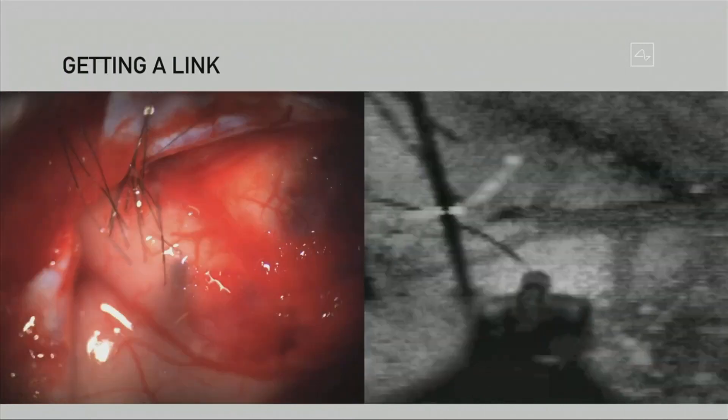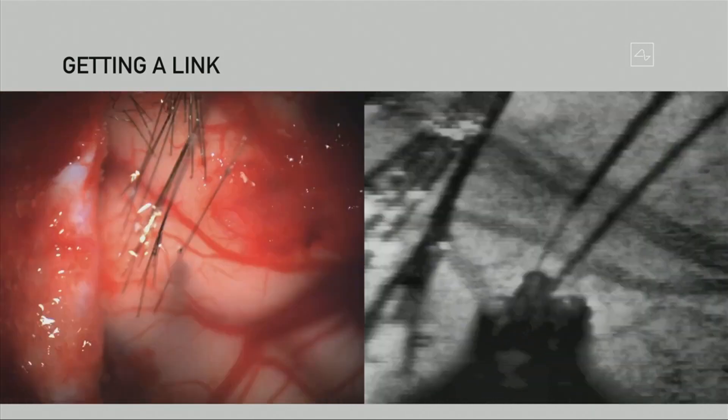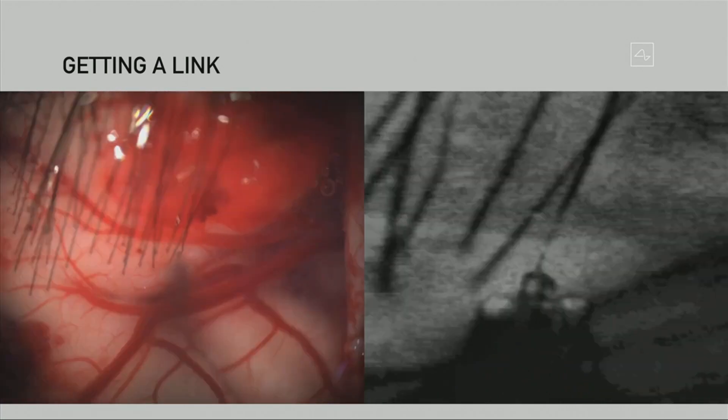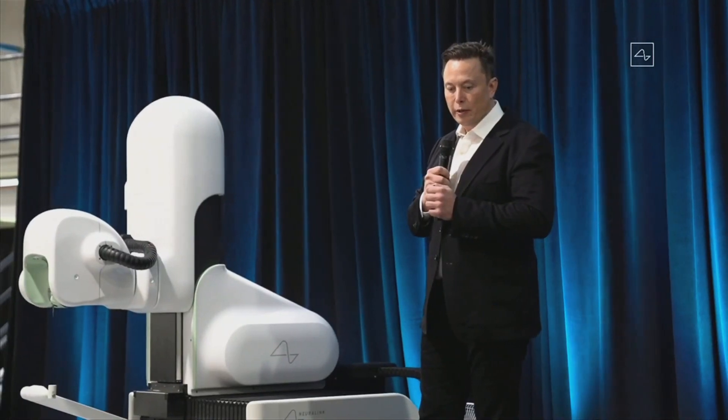This shows a close-up view of the electrodes being inserted in the brain. If you look closely, you'll see it's a little counterintuitive: if the electrodes are inserted very carefully, there is no bleeding. With very tiny electrodes inserted carefully, the robot actually images the brain and makes sure to avoid any veins or arteries, so the electrodes can be inserted with no noticeable damage.